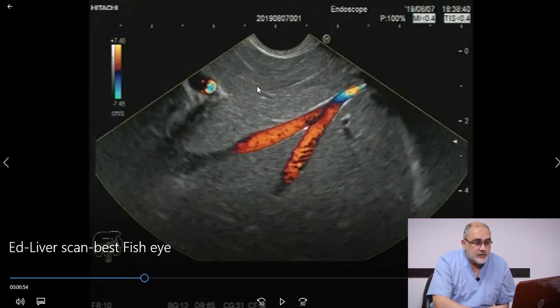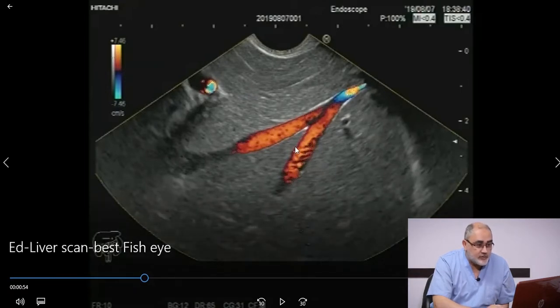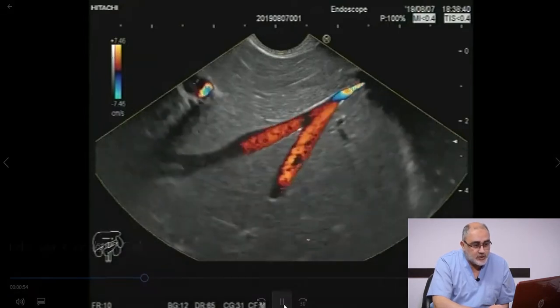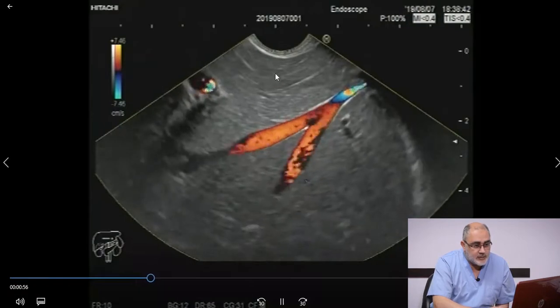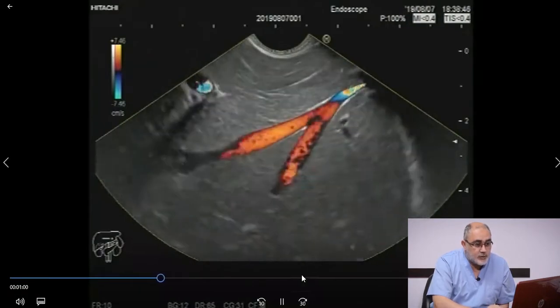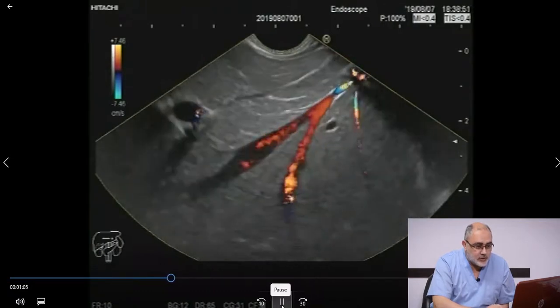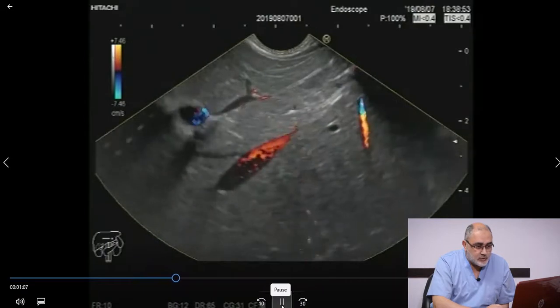communicating the inferior vena cava to the left portal vein, umbilical portion of the left portal vein, and this is the middle hepatic vein having the homogeneous diameter, and we can see a long part of it during echoendoscopic examination. Yes, very nice. 1, 4A, 8. Then we keep counterclockwise rotation.